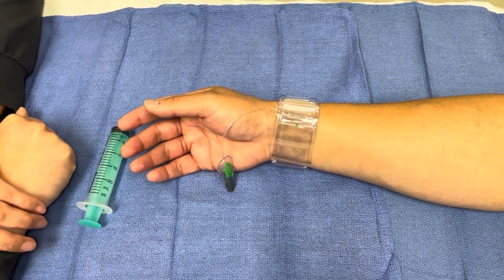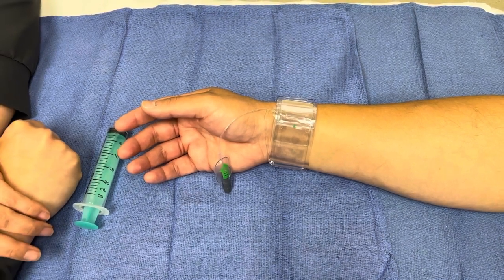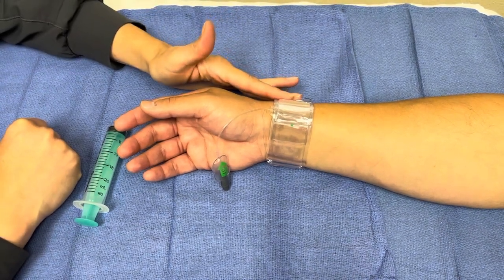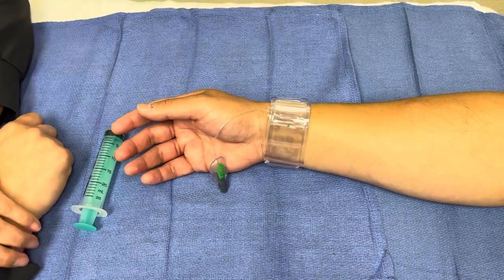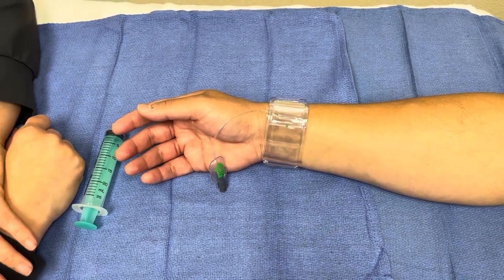Once the band is ready to come off, it is recommended by the rep to let the patient get up and around — let them go eat, let them go to the bathroom. That way the band is still in place. All the air may be out, but it's still in place. So if they start re-bleeding, you can add two to three mils of air back into it and you won't have to hold pressure and call the doctor.